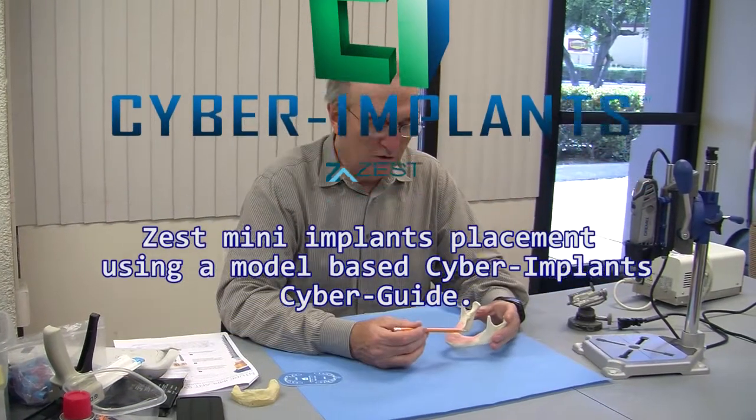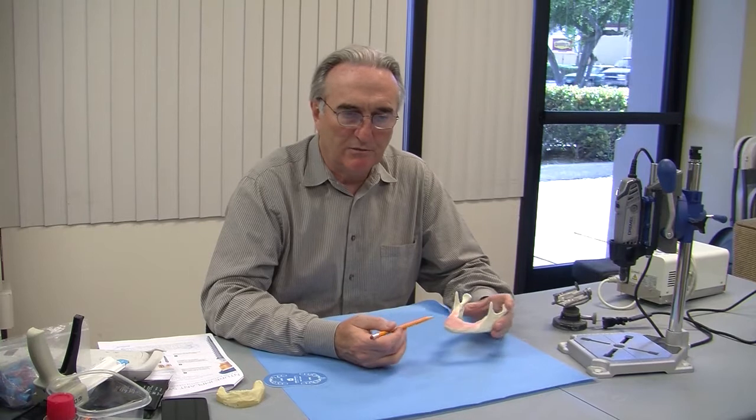Surgical guide using the Cyber Implant system can be used with a model base or a CT base. The mini implant can be placed with software, and then we can export the position of the implant to fabricate a frame. We can also do that through a model base with different instruments, using the same component at the end. So we are going to demonstrate the model base system.